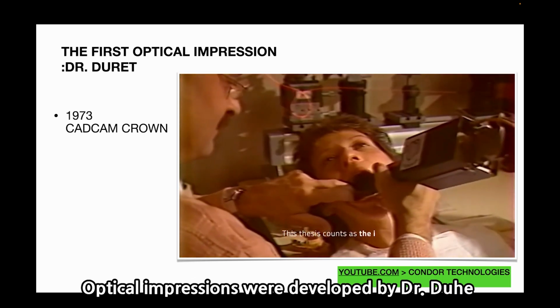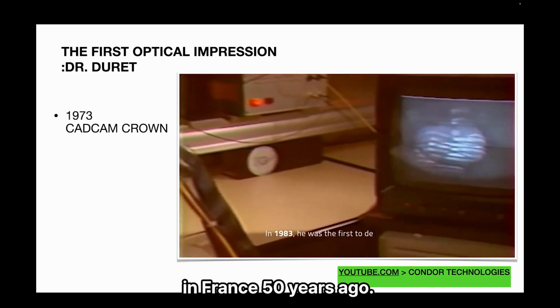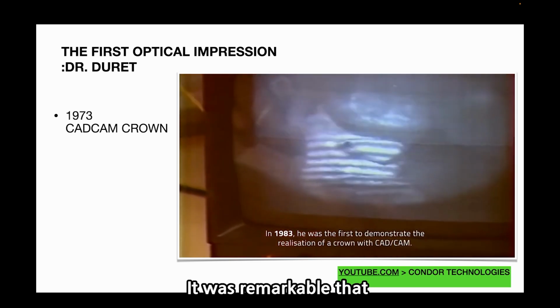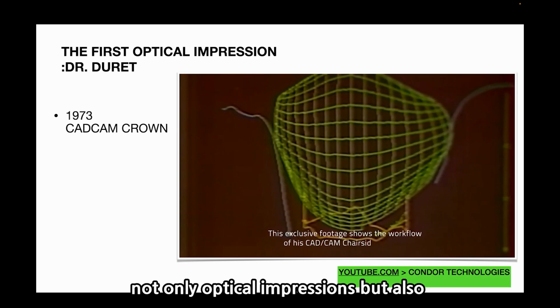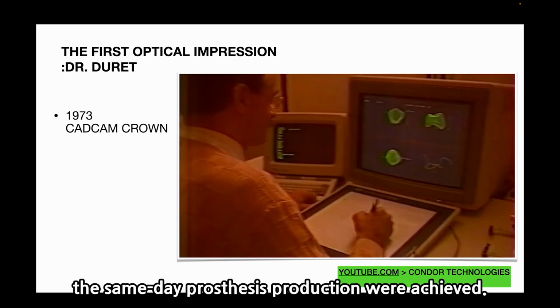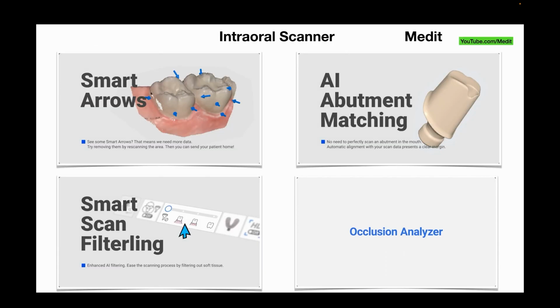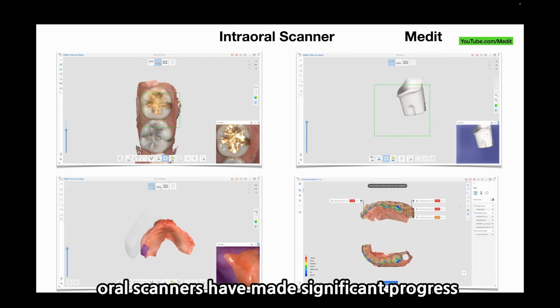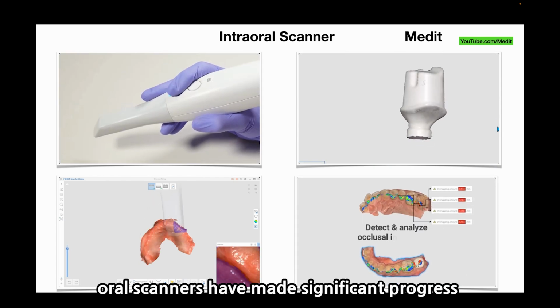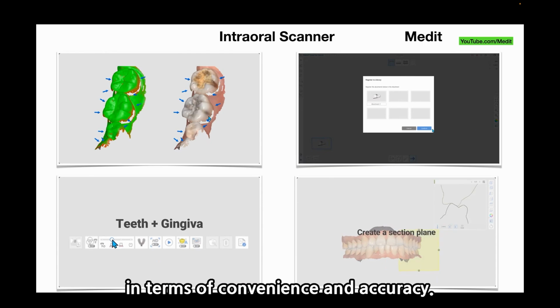Optical impression was developed by Dr. Duret in France 50 years ago. It was remarkable that not only optical impression but also the same-day prosthesis production were achieved. Since then, intraoral scanners have made a significant progress in terms of convenience and accuracy.